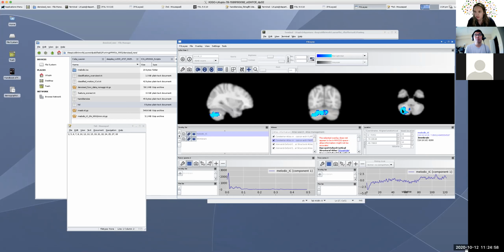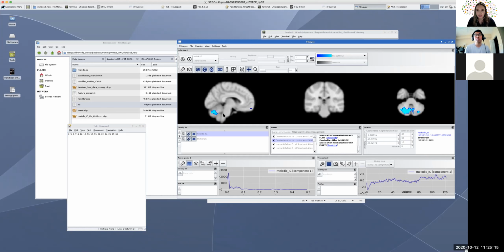So here, this is just the cerebellar one, so it doesn't tell us any information about white matter or gray matter. So usually Jason has us keep the cerebellum data, so we don't classify that as noise. But again, if it's in the brainstem, then we will classify that as noise.